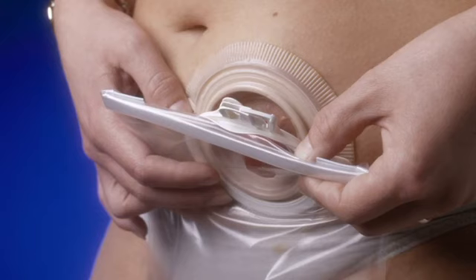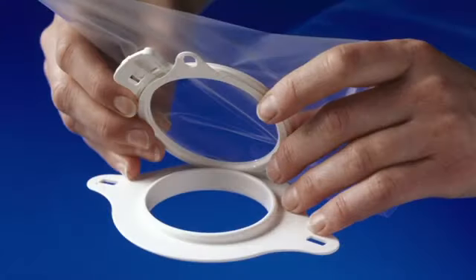In the following, the irrigation procedure is demonstrated when normally using an ostomy bag that is attached to a base plate by plastic coupling. If you do not use such a system, you can irrigate by attaching a pressure plate to the skin with an irrigation belt.